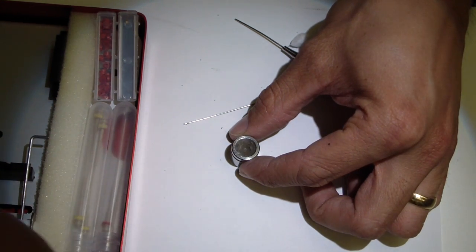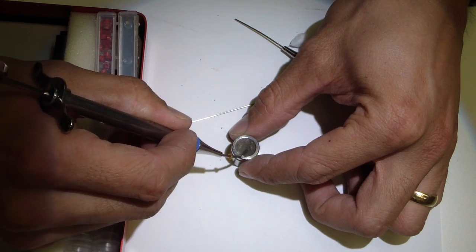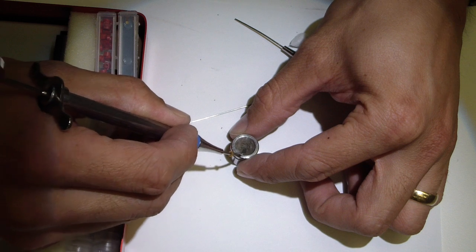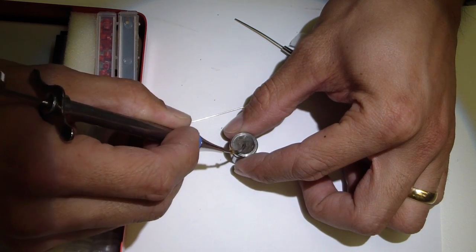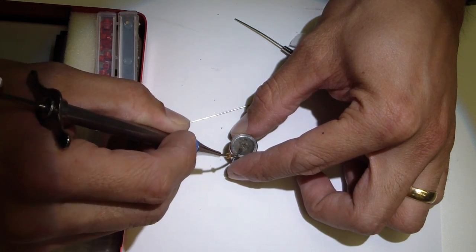You can see I removed some of that there. There we go. It's a real kind of, just got to do it for yourself to figure out. Once you do it once, you'll never forget.